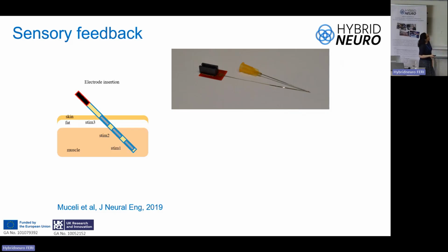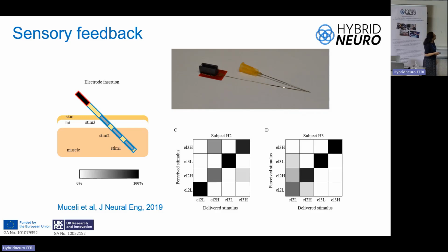So the idea was, why not design an electrode that can record the EMG signal so that we can understand which muscle a person wants to activate, so which function of the prosthesis they want to activate, but also that contains stimulation electrodes so that we can actually provide sensory feedback.